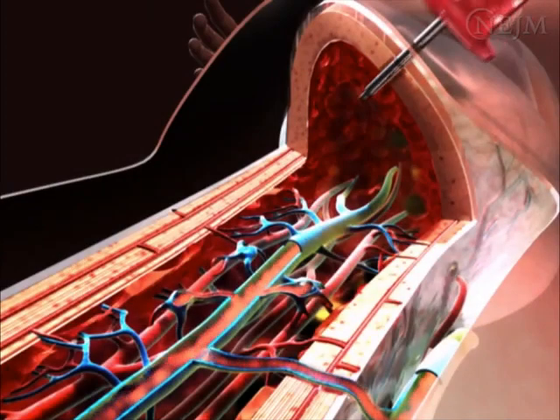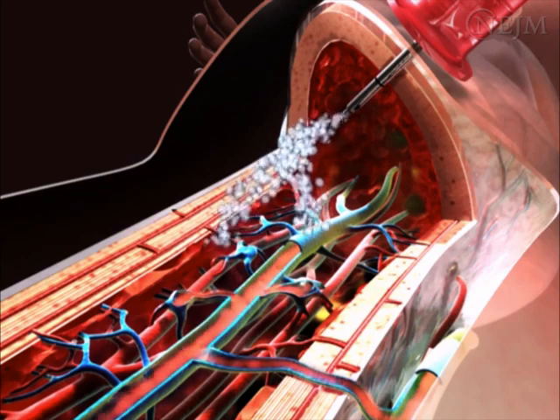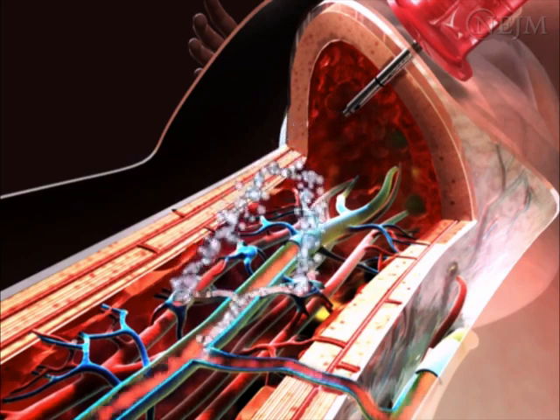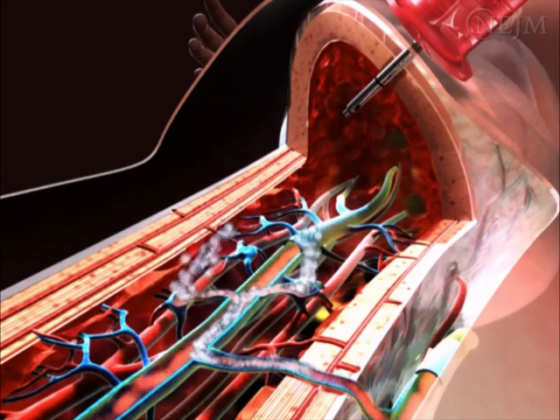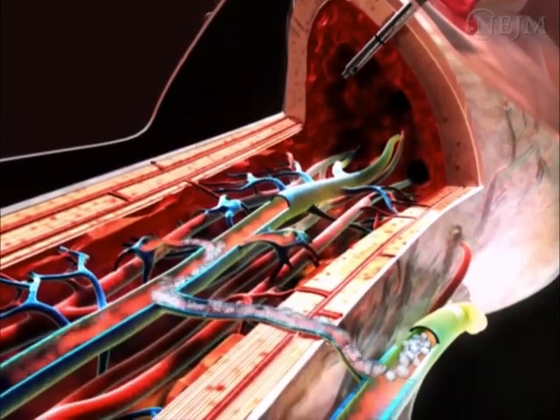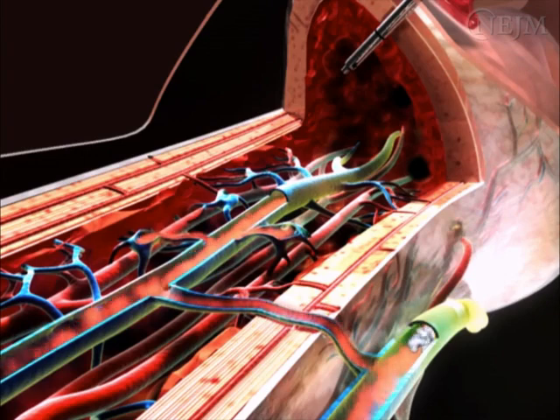The medullary cavity is a highly vascular structure that functions as a non-collapsible vein capable of accepting a large volume of fluids and medications and rapidly delivering them to the central circulation. The medullary venous sinusoids drain into a central venous channel, which exits the bone in the form of emissary and nutrient veins. The rate of infusion is limited by the size of the medullary cavity and the diameter of the intraosseous needle.